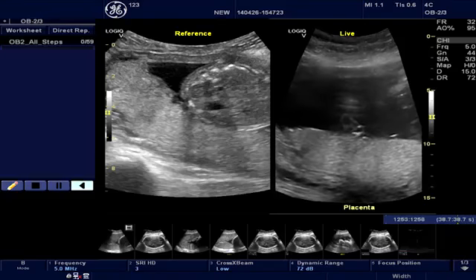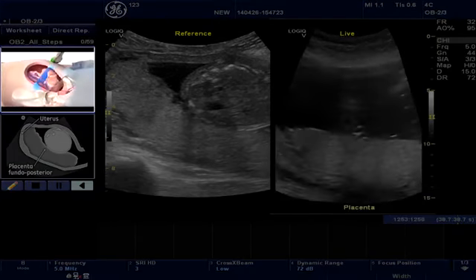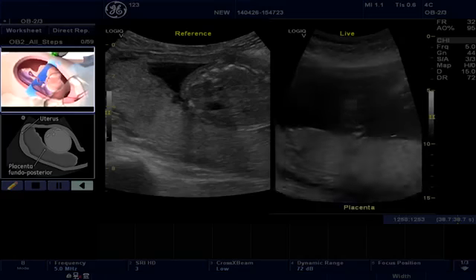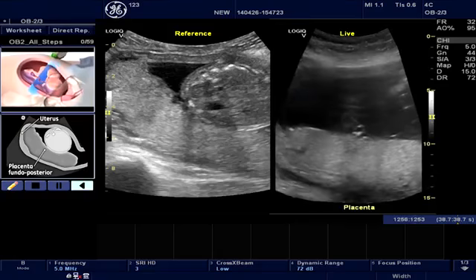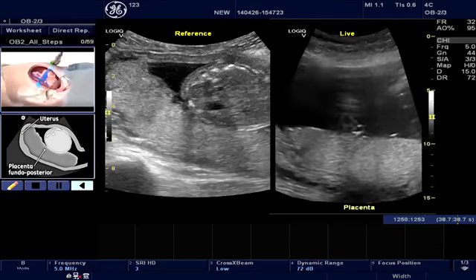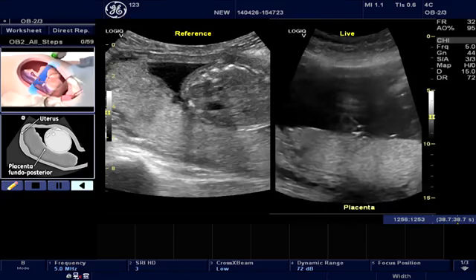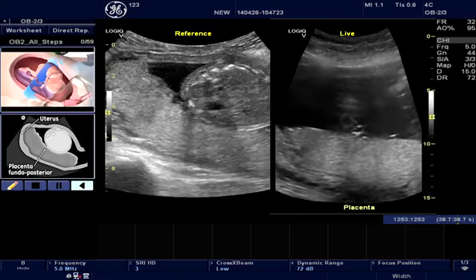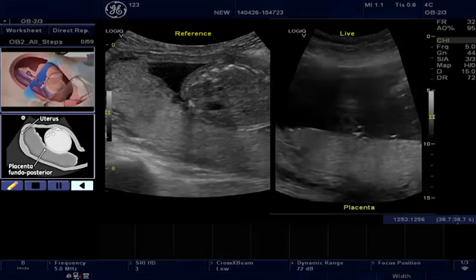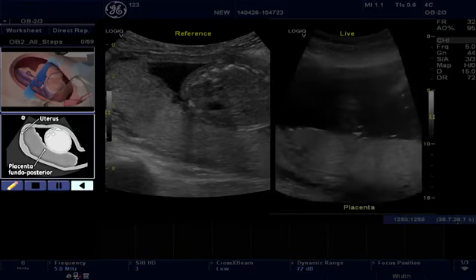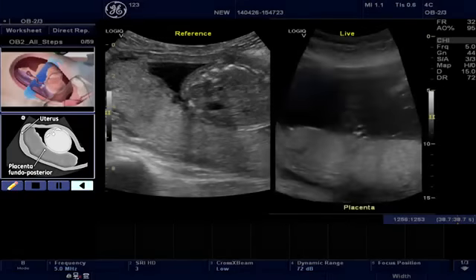This brings up two animation windows. The top window shows a 3D representation, providing information on the beam formation within the 3D representation of the anatomy within the target organ. This animation also provides some indication of probe placement position on the patient's body for acquiring the selected scan plane. However, for applications like obstetric, this is dynamic as the baby is moving constantly in the mother's womb, so the shown probe position may not apply for all fetal presentations. The lower window shows a schematic illustration of the reference image, with annotations of key anatomical structures that help users identify structures on the reference image.